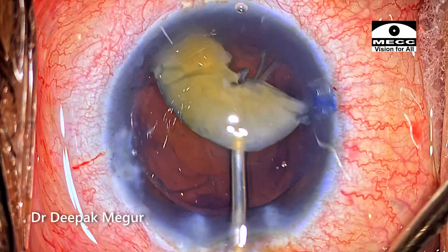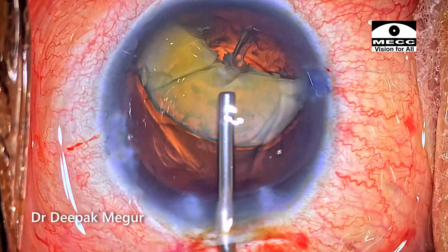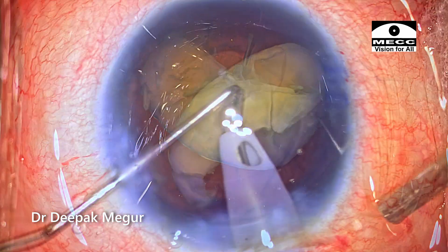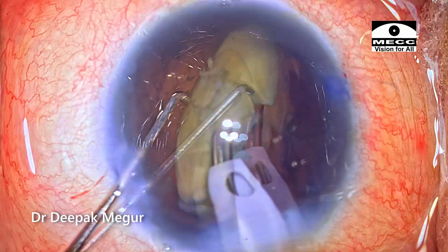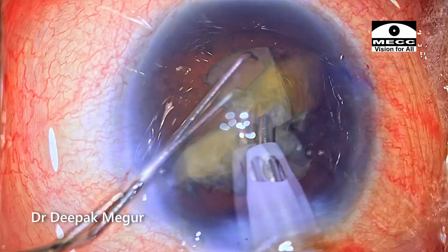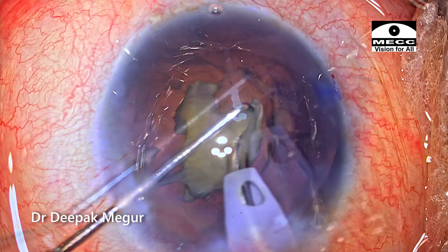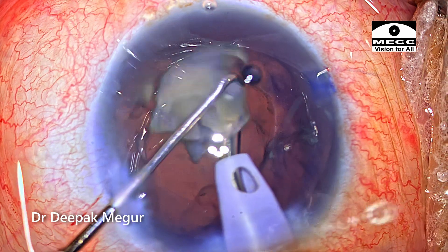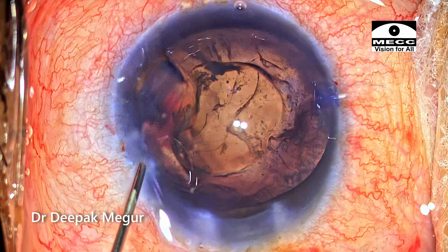The nucleus fragment is literally suspended in between the OVD. We have put enough OVD in front of it and also behind it in the capsular bag. Slowly and steadily the remaining fragments are gently emulsified. I think even in most complex cases, if you're ready to be a little more patient and slow down the surgery, most of this can be performed quite safely in a controlled manner. The last fragment is emulsified uneventfully.